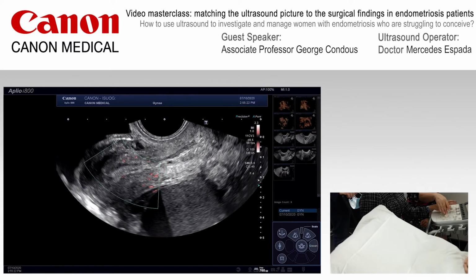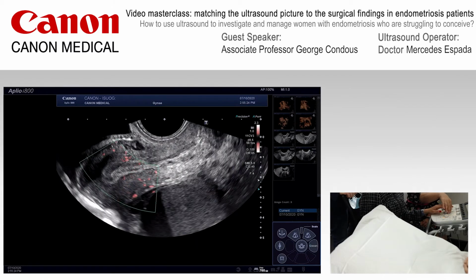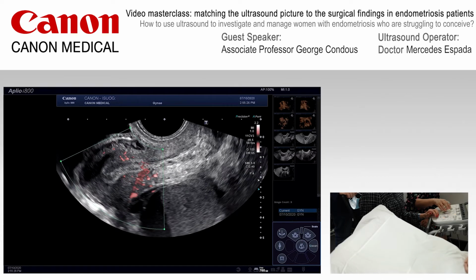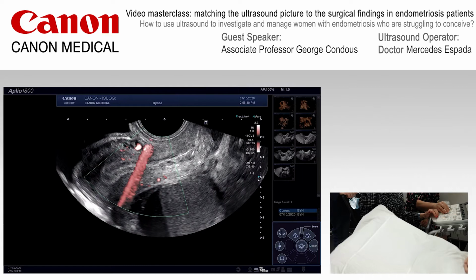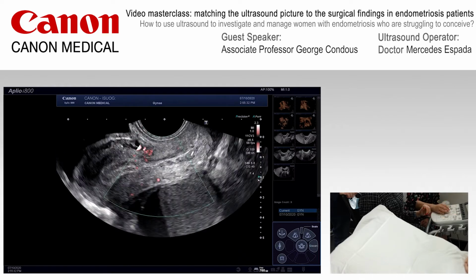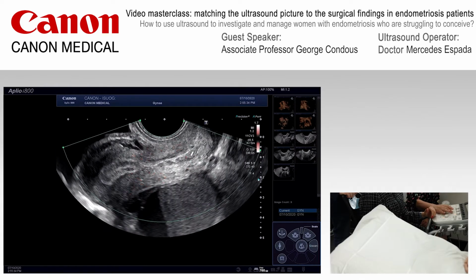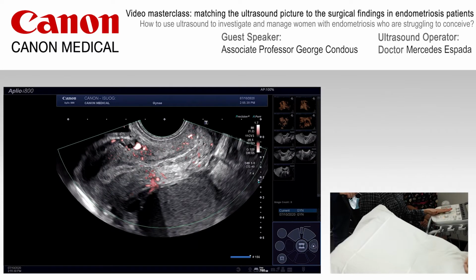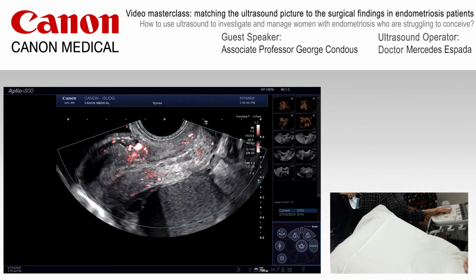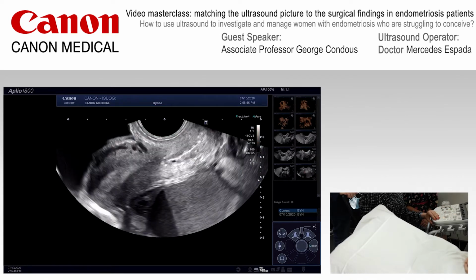We want to see whether there's any presence of endometrial or myometrial cysts. We want to look for diffuse linear striations within the actual muscle wall itself, look at the vascularity of the muscle itself, see if there's any budding as the endometrium infiltrates into the muscle itself, and then we would get a nice 3D view, getting a coronal view at the end, just to make sure that there's no disruption of the junctional zone.